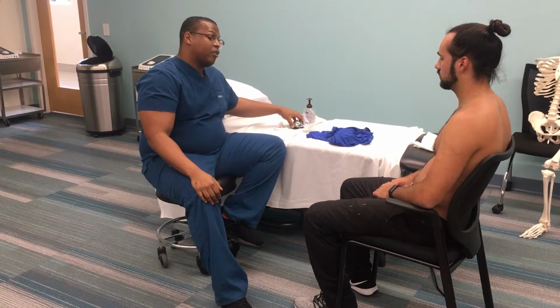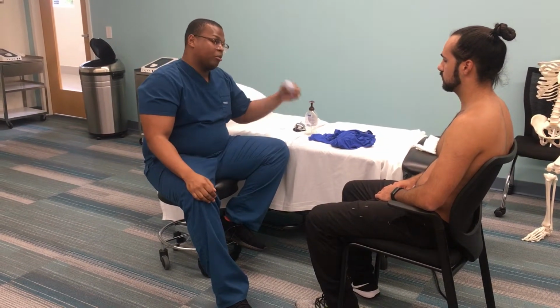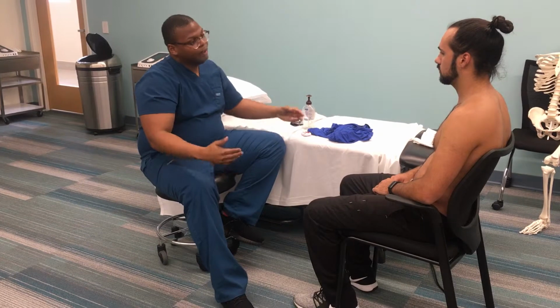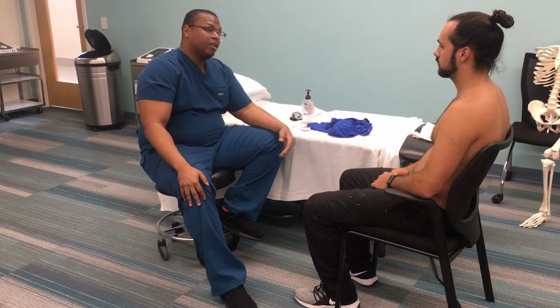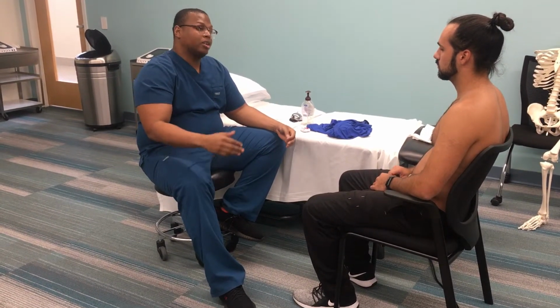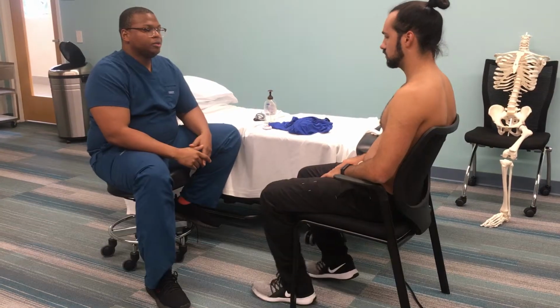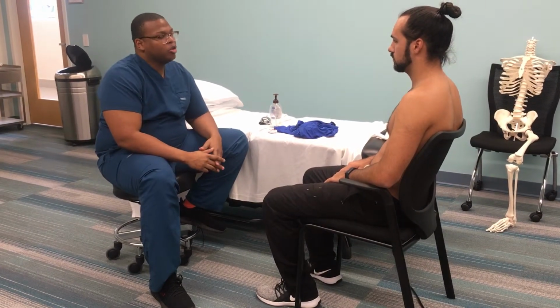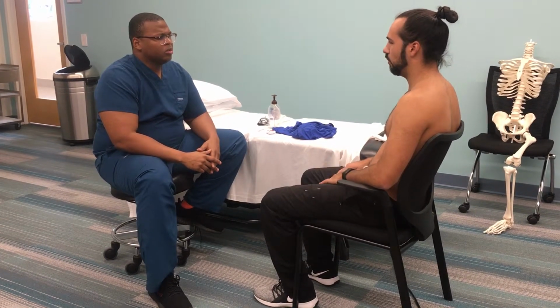Okay. What I'm gonna do at first is place the hot pack on you. Then I'm gonna set this timer and come back in 5 minutes to reassess and see if everything's going according to plan. If I don't see any adverse reaction, I'm gonna talk to you, and then we're gonna keep going for 15, 20 more minutes, okay? The last thing I wanna know before we begin is, what's your pain level right now? It's about a 4. 4?